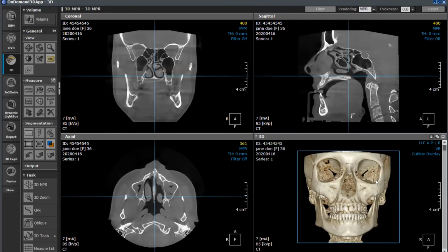So another question is smallest voxel to be captured. With voxels, ours goes down to 0.1 millimeters. So that is the smallest that we have. Now, you may be seeing in the marketplace, you hear people talk about that they have something like a 0.08 or 0.07. We didn't choose 0.1 because we couldn't go any further. We did it because at a certain point, you're going to get more signal to noise ratio as you get into smaller and smaller voxel points. So we chose a clear voxel point and something that our algorithm can then make into clear pictures.